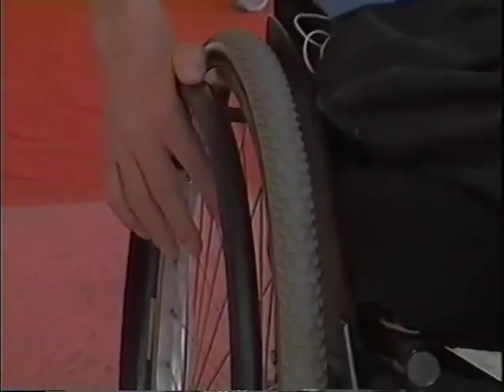Another thing that you can do, if you're not going to use lugs or projections, is to use knobby tires with high friction plastic hand rims. I used the knobby tires for about 3 years, and after I got done with those, I used these high friction rims. The wheeling techniques are the same as a paraplegic, but the only difference is I use a tire to start with, to push my hands on the tire.